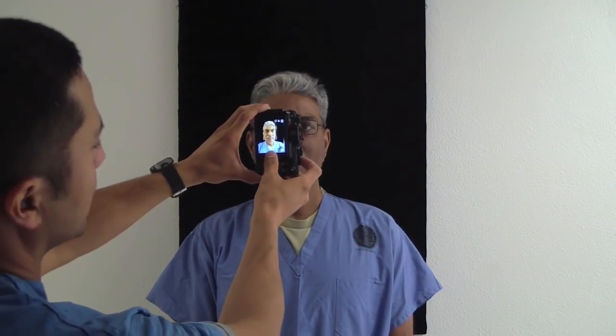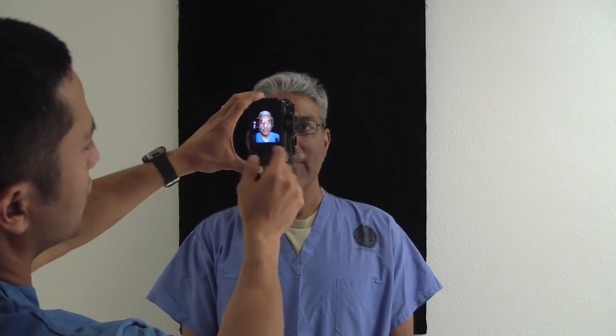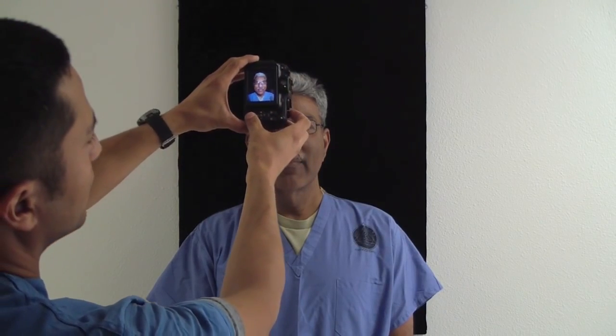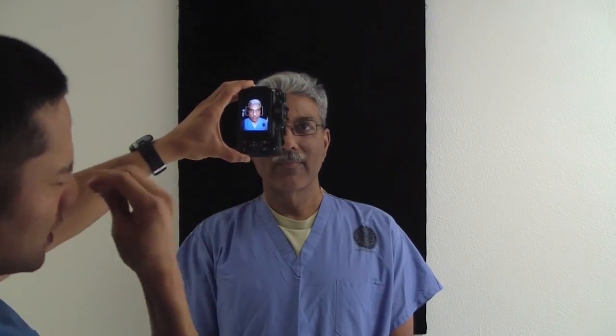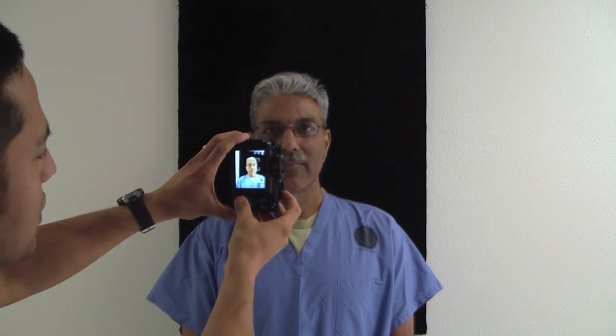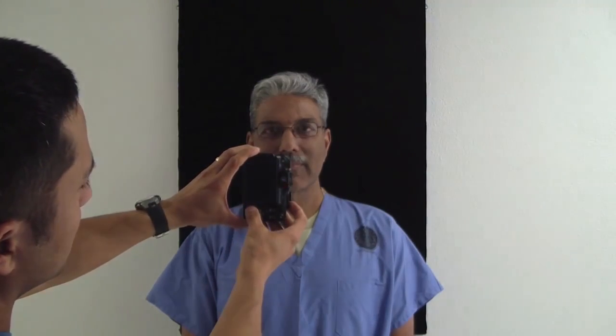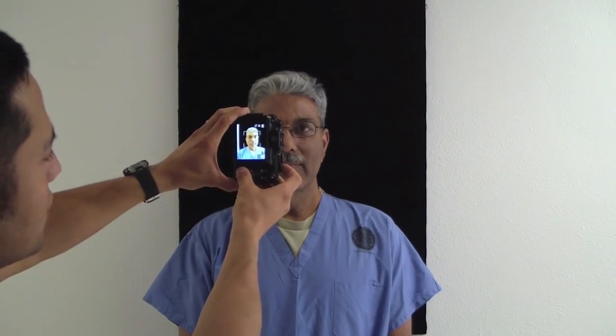So I don't need his whole body, perhaps if you want that in your presentations or your photos, but we do want to get closer up. Remember, you see we have a bunch of glare there, we want to remove that, so I'm going to angle up. Of course, as I angle up, that changes the whole perception of his face. So it's sort of a balance of everything. We'll take one down here. That's a nice photo.